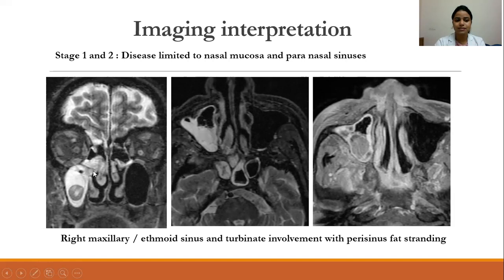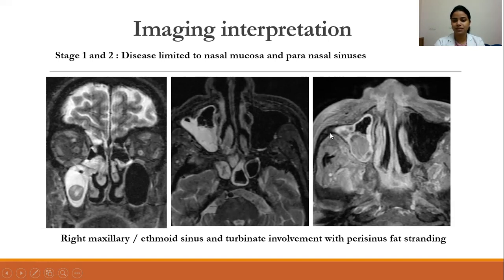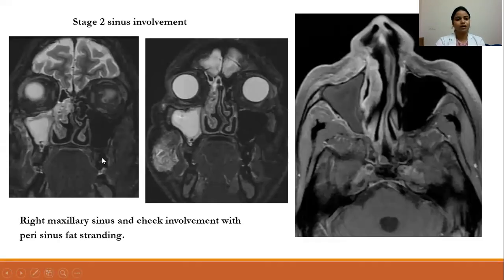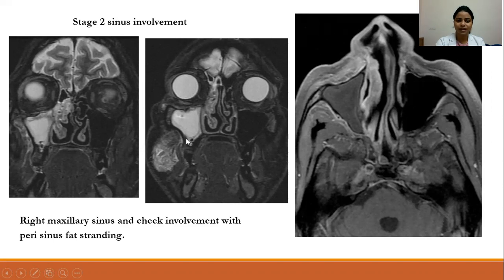In imaging interpretation, coronal and axial STIR sequences showed polypodal mucosal thickening of the right maxillary sinus with involvement of the right turbinate. Post-contrast showed peripheral enhancement with a central non-enhancing area and perisinus fat stranding. Another patient showed polypodal mucosal thickening of the right maxillary sinus with involvement of the right cheek showing edematous changes, and non-enhancement of the mucosa with perisinus fat stranding.